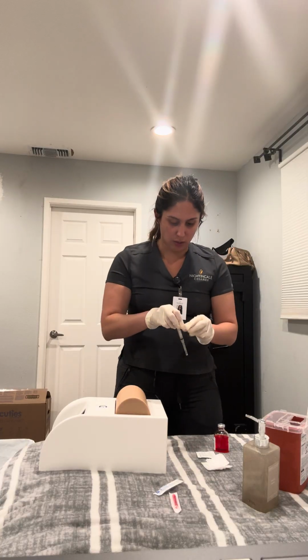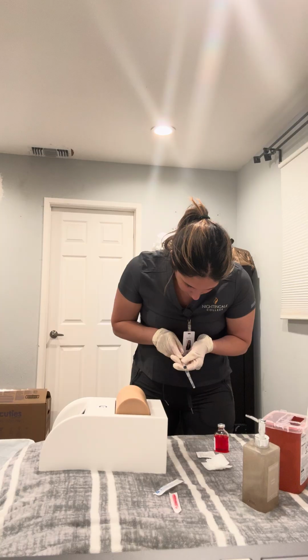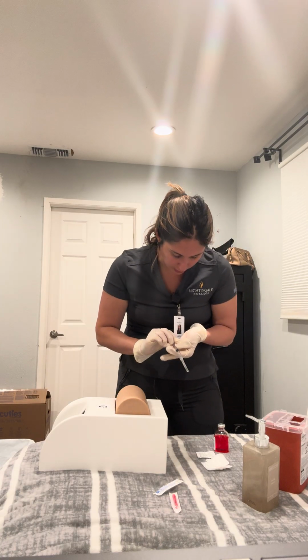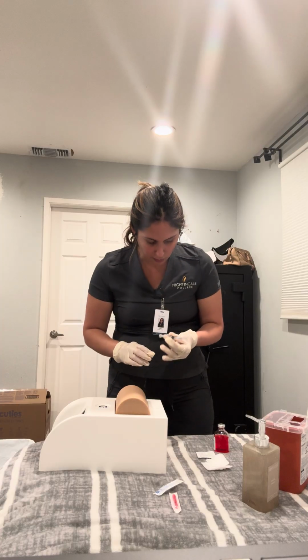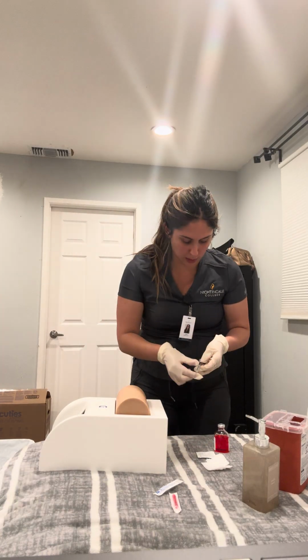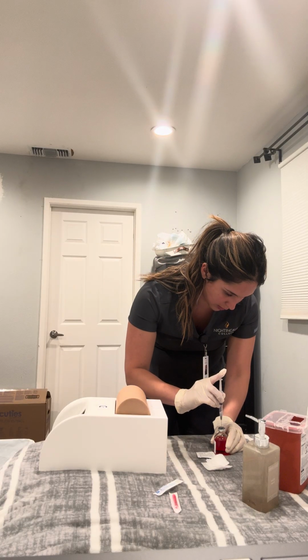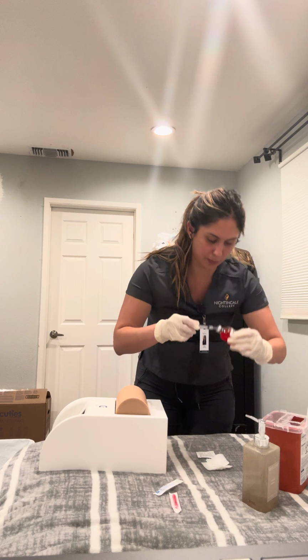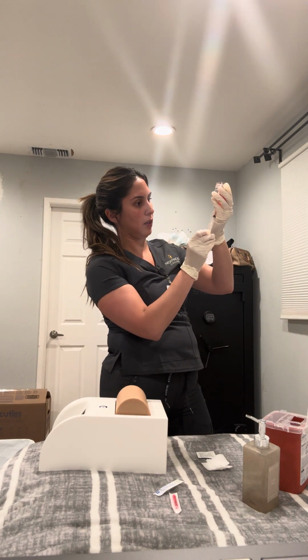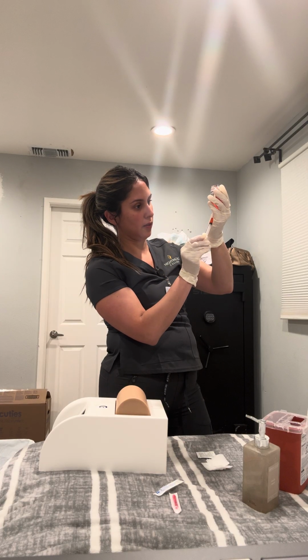We're going to face it down, pull the plunger to the level of air, 1.5, then take off the cap and inject the air into my bottle, and we're going to face it forward and go to 1.5.